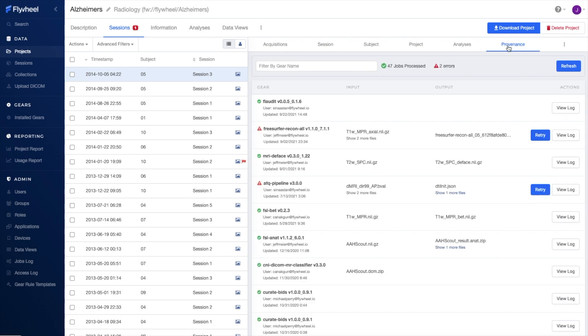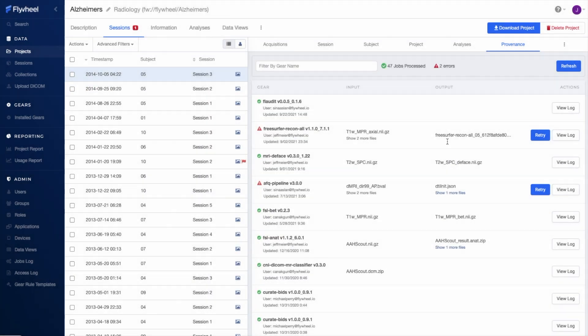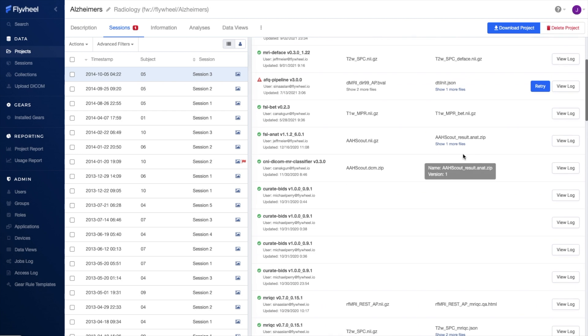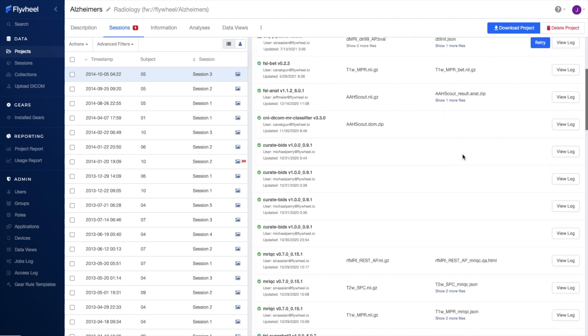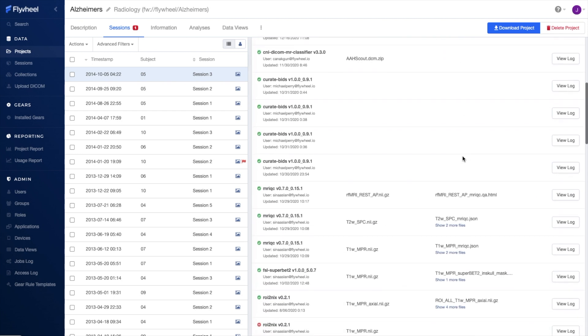Finally, to support reproducibility, here in my session's provenance tab, I have a detailed log of all utility and analysis jobs executed against my session's data. This includes the gear and algorithm version, as well as the input and output details.